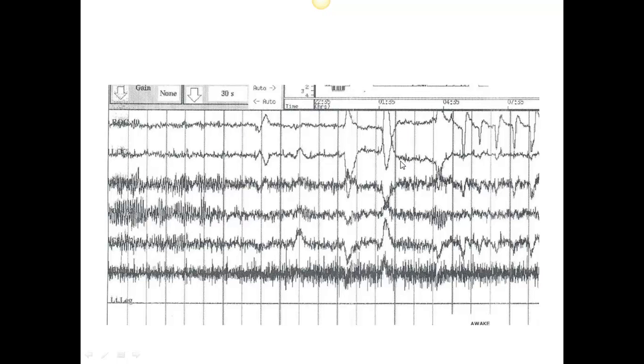Then we start to see these eye movements that could almost fool us to thinking it's REM if we just looked at the eyes. But we still see alpha activity, it's just definitely decreased compared to the alpha activity in this first segment of the epoch. And our other dead giveaway that it's awake is that the chin muscle is really active with a really large signal there.